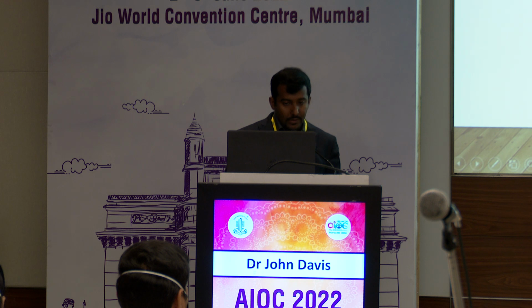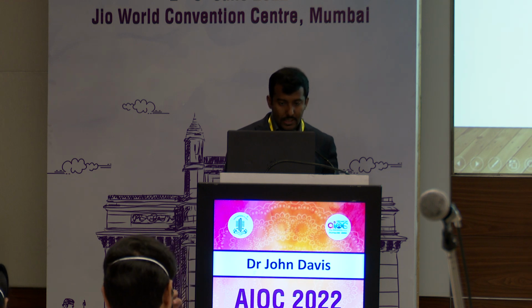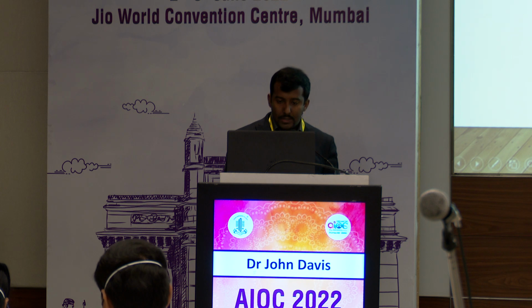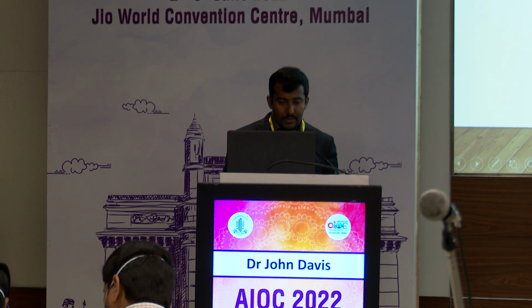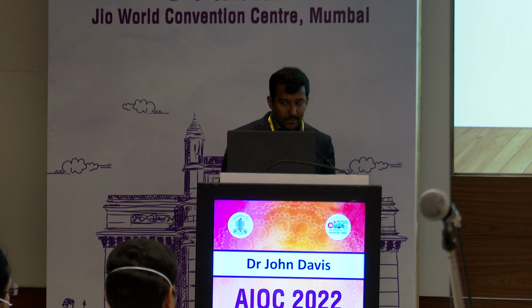So the limitations of our study are a small number of images. We used only 58 images for both training and testing, and also there is a resolution limitation with the free Teachable Machine, and it is also not capable of highlighting hotspots to show what part of the image resulted in the diagnosis. So that is the black box problem of AI. These are my references. Thank you.